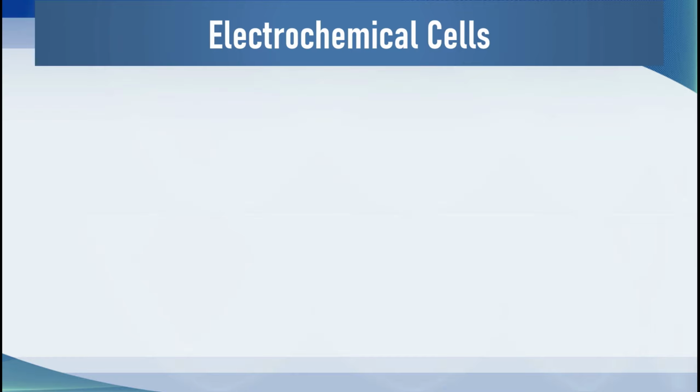Since the beginning, the electrochemical cell system has been called by the singular term electrode, so I'm going to use that terminology. In blood gas electrodes, there are glass or metal electrode terminals. A pair is known as a cell, and individual components are half cells.